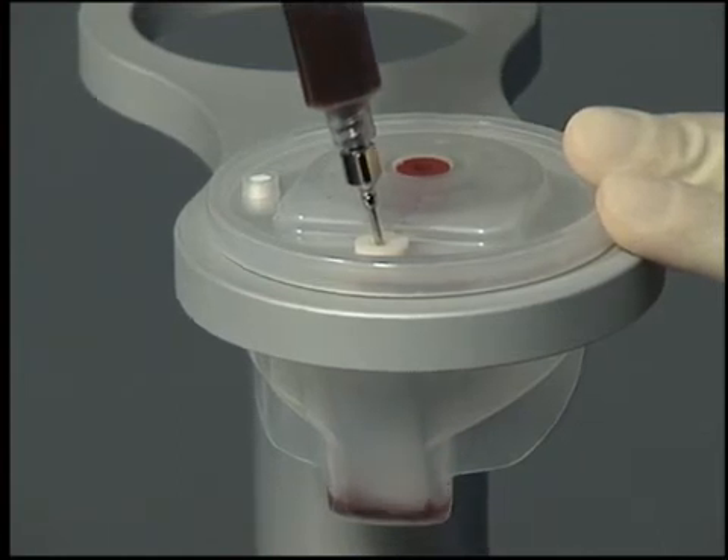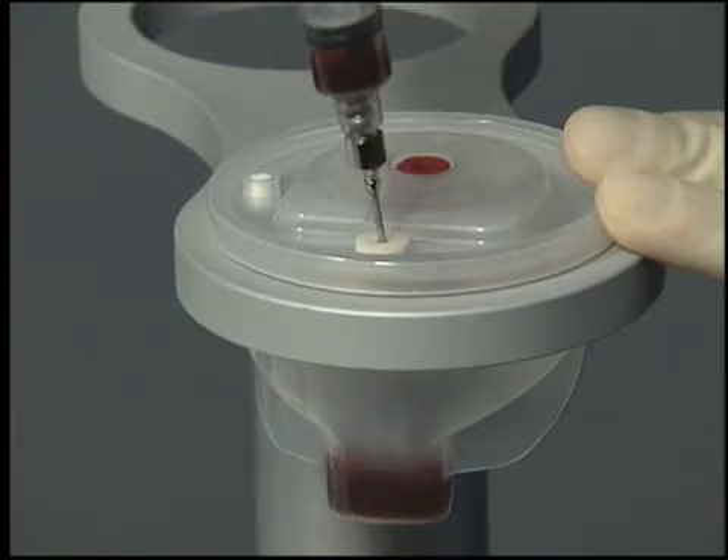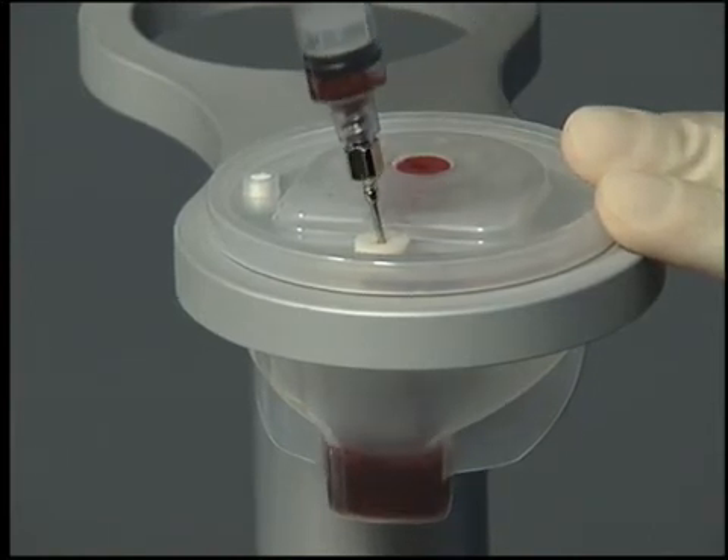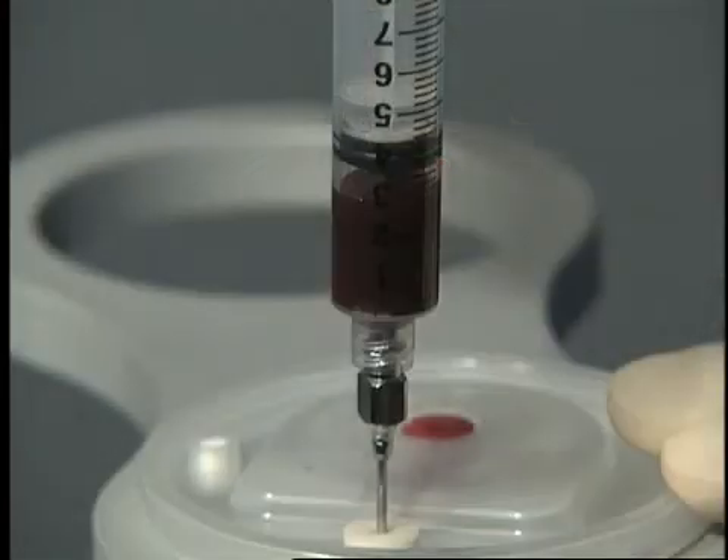Observe the base of the plasma chamber to confirm that all the platelets have been resuspended, then withdraw the APC plus into the syringe.